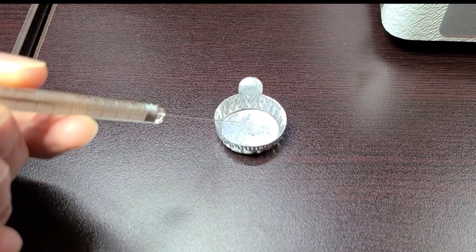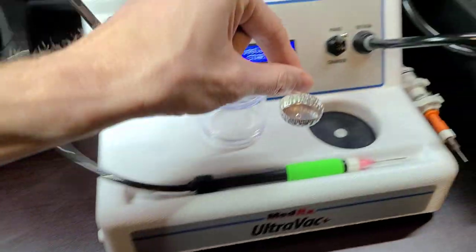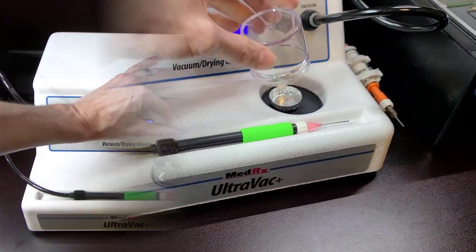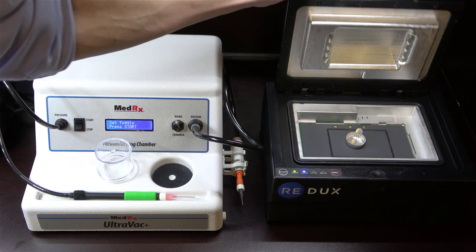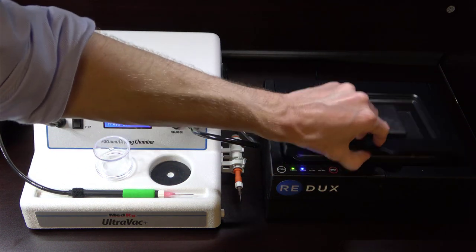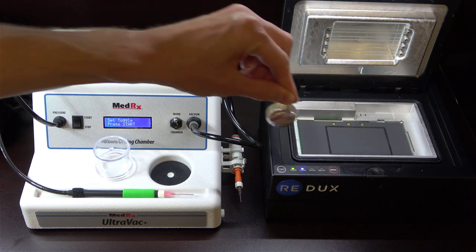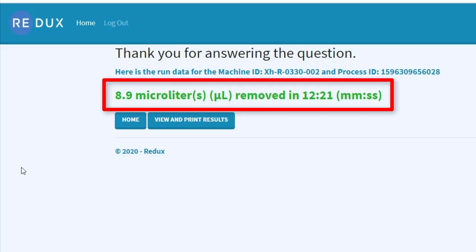The first thing I decided to do was place a 10 microliter drop of water onto a metal tray and place it inside of the bell jar dehydrator to run it for a full four minute cycle. At the end of the cycle, I placed what remained of the 10 microliter drop of water inside of the Redux chamber to measure how much of the water was removed by the bell jar dehydrator. After a 12 minute cycle inside the Redux, we can see that the rest of the drop is completely gone. However, the most important thing to note is how much moisture the Redux detected — that number was 8.9 microliters. This means that after a full four minute cycle inside of the bell jar dehydrator, it only removed 1.1 microliters of moisture out of the full 10 microliter dose.